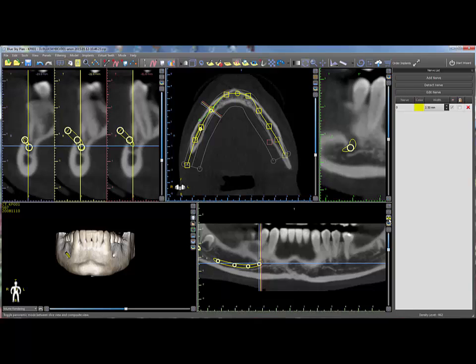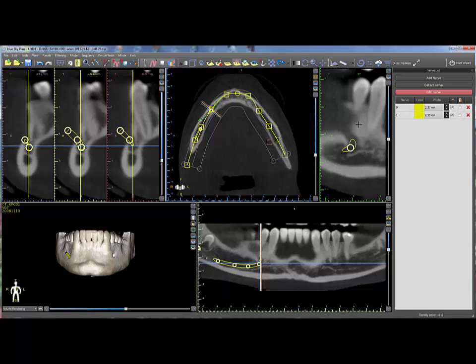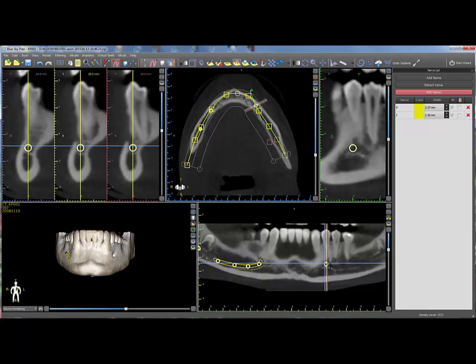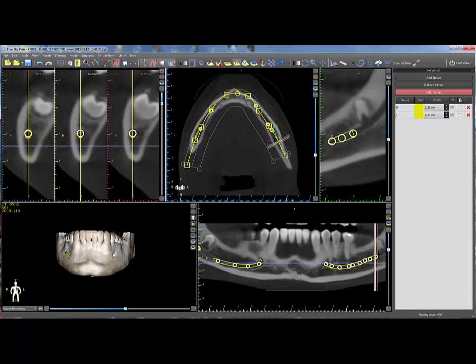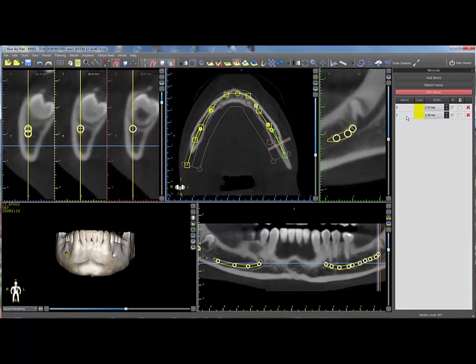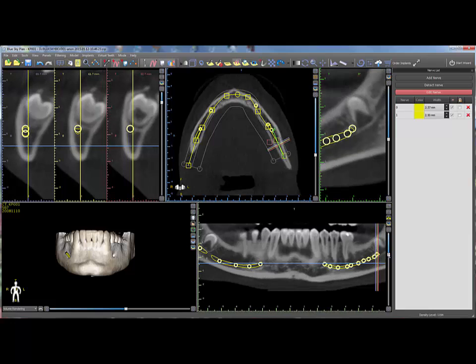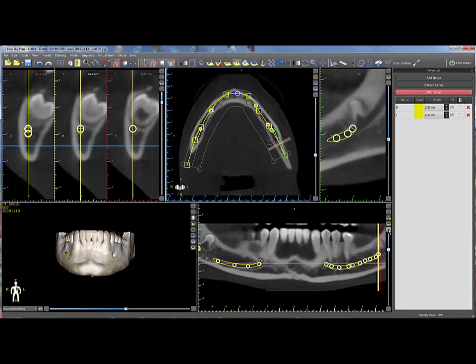Click the slice composite icon to ensure being in slice mode. Click the add nerve button and click and move the cursor to draw the nerve. A new nerve number will be added to the nerve list. If necessary, the user can continue a nerve through different panoramic slices by adjusting the vertical slide bar or the up and down arrows.